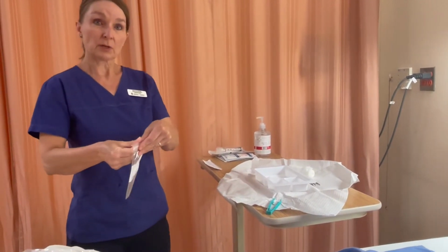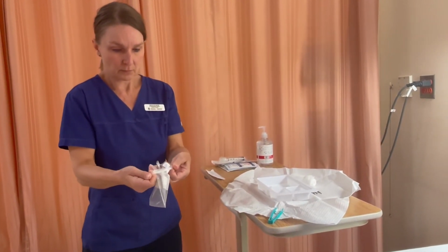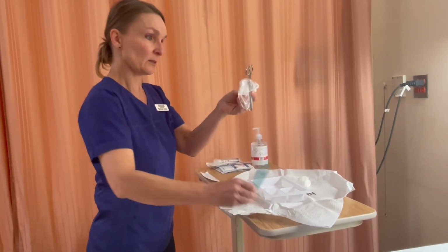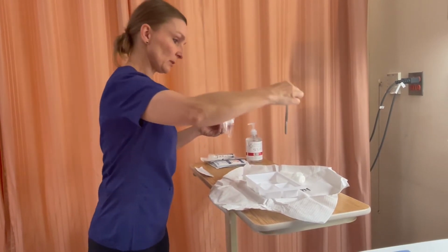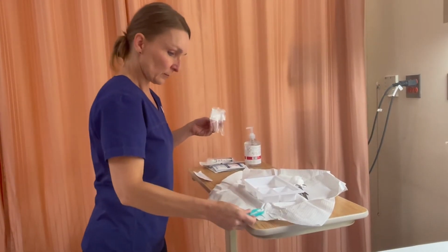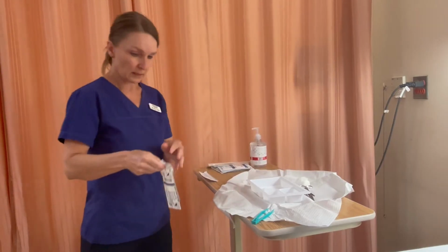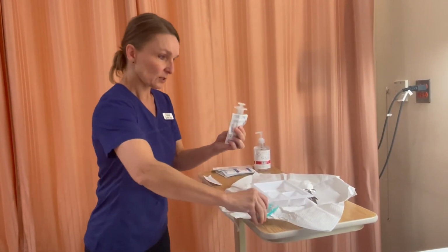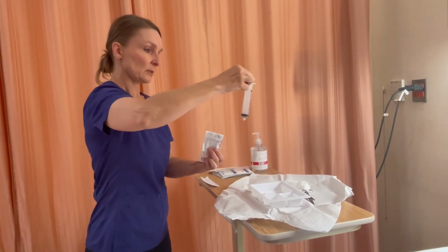Again, scissors can be tricky to remove from a package, so if you grab them by the handles, that is the heaviest portion. I'm holding the winged back portion, and you'll find you'll have the most control. You'll be able to maintain a steadiness. I need a 30 ml syringe. I'm opening away from my sterile field. Slow and steady.